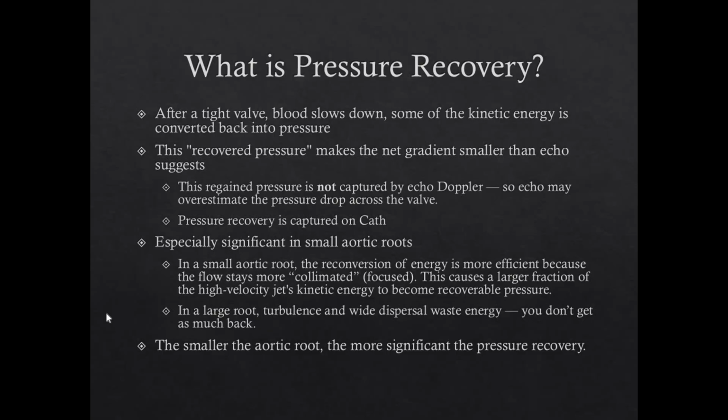What is pressure recovery? After a tight valve, the blood flow slows down, and some of that kinetic energy is converted back into pressure. And this recovered pressure makes the net gradient smaller than what the echo shows. That is because the regained pressure is not captured by echo Doppler, so echo will overestimate the pressure drop across the valve, whereas pressure recovery is captured on cath.